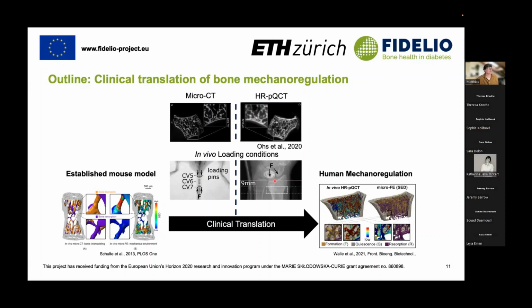And the other difference is that even though HR-pQCT is really promising, with really good increases in resolution from the previous versions and from QCT, it is still not at the level of micro-CT imaging, where micro-CT is really high resolution. As you can see here, we have a really crisp image of the bone surface, whereas in HR-pQCT, it's still fairly blurry compared to that.